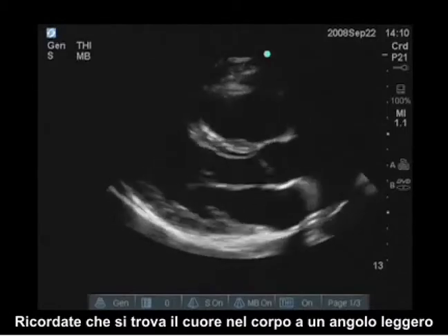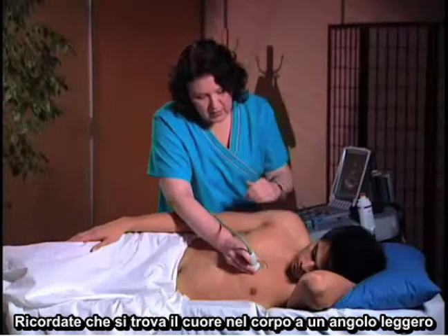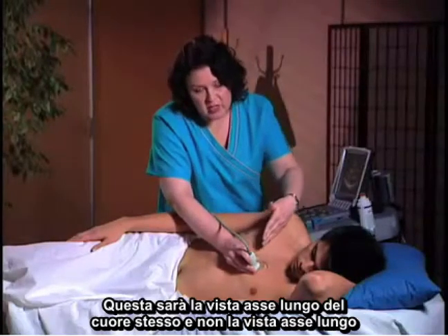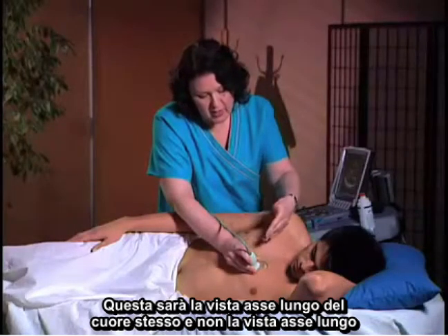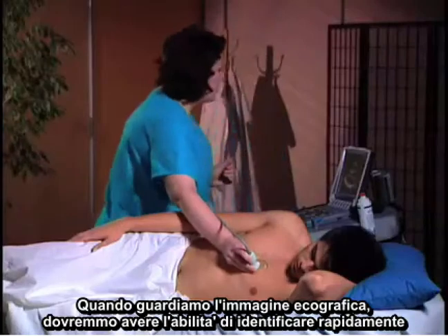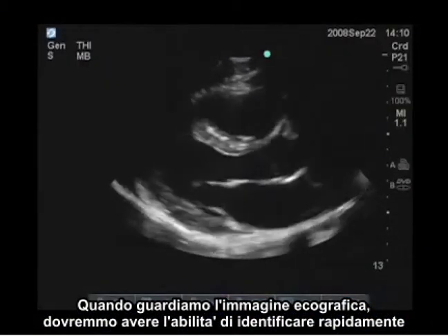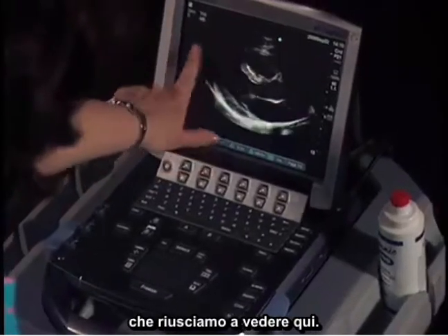Remembering that the heart sits in the body at a slight angle, this is going to be the long axis view of the heart itself — not the long axis of the body, but the long axis of the heart. When we look at the ultrasound image, we should quickly be able to identify the left ventricle, which we see here.